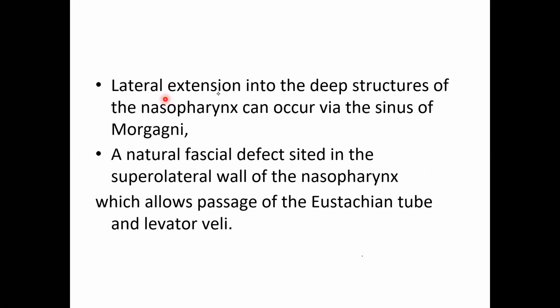And lateral extension into the deeper structures of the nasopharynx can occur via the sinus of Morgagni. That is, we are dealing with nasopharyngeal carcinoma. Once again, the pictures are very different from previously. Lateral extension via the sinus of Morgagni should be kept in mind.